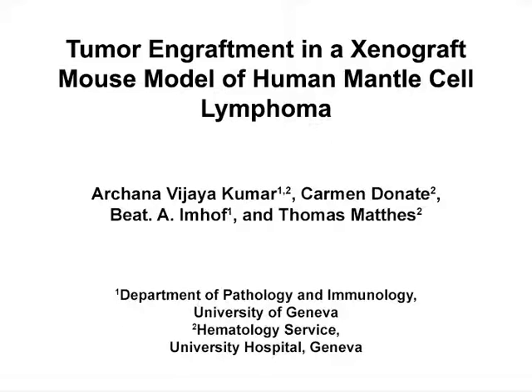The overall goal of this method is to establish a xenograft mouse model for mantle cell lymphoma to develop treatment strategies for this disease. This method can help answer key questions in the field of hemato-oncology, such as therapeutic outcome of different treatment strategies. The main advantage of this technique is that it allows us to study the effect of drugs on human lymphoma cells in vivo.